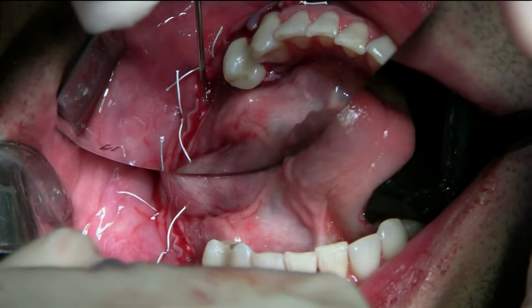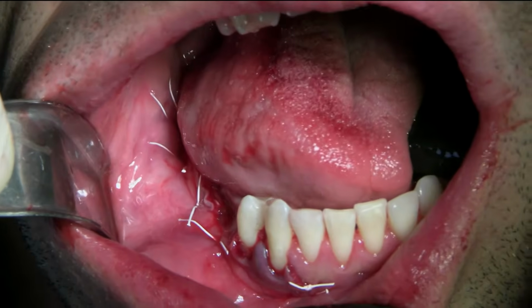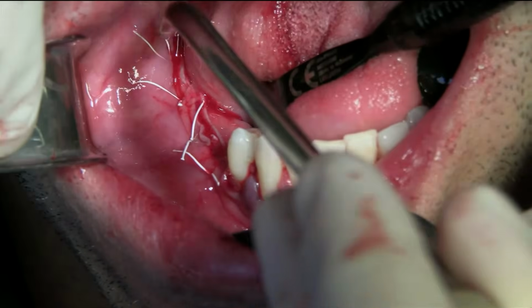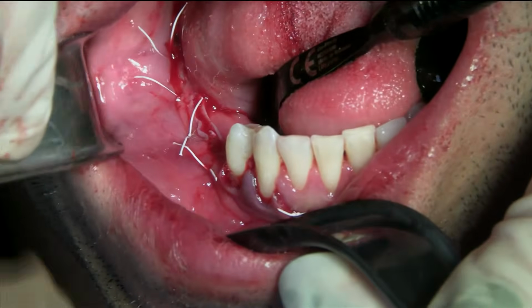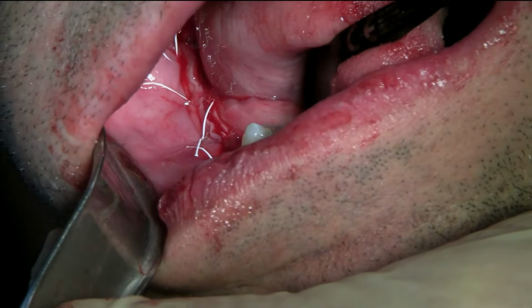You want the mirror or this? That's good. Okay, we're good. So I'm closing with single interrupted. Retract the tongue. Retract the cheek. Come from here. Yep. So now we're going to finish everything.